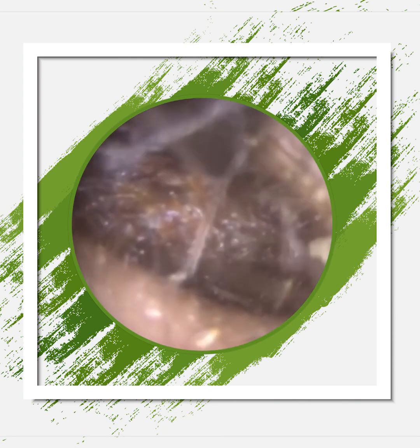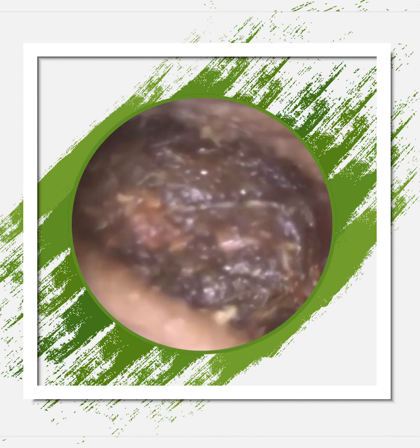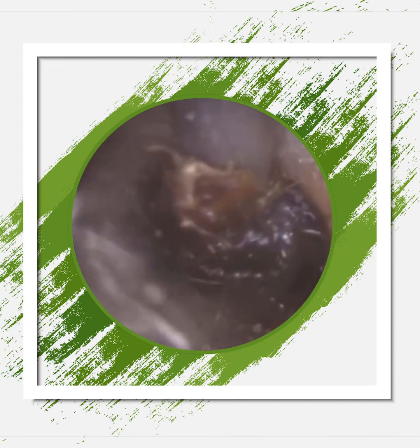So I've just decided to use some forceps now. Just trying to get the jaws of the forceps either side. Managed to remove a little bit there. There's nothing more for me to grab onto now, so I'm going to have to go back in with the Zollner suction probe. Can't use a hook or a Jobson horn at that stage because there was no opening. To use an ear hook or a Jobson horn, you need an opening to get in and behind the wax. There's nothing there available. Nonetheless, managed to remove it using suction.